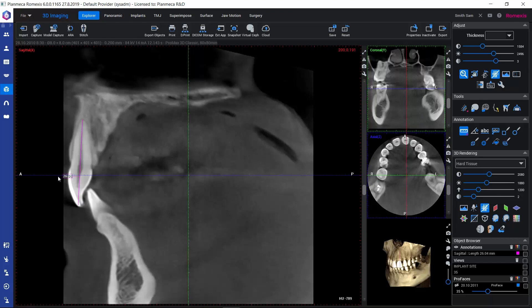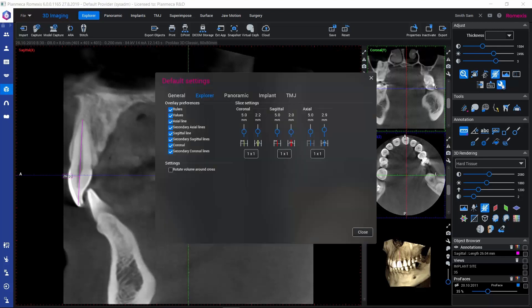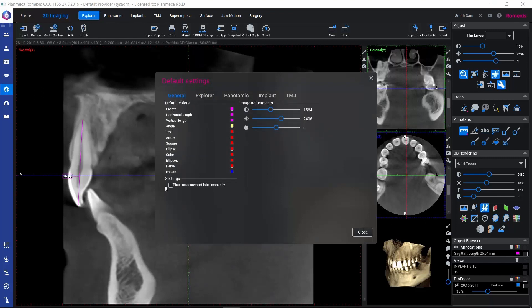By default, the measurement label is placed somewhere here, and if you feel that it's disturbing you, there's also another mode for positioning the measurement label. We can go to default settings and select in the general tab the option to place the measurement label manually.